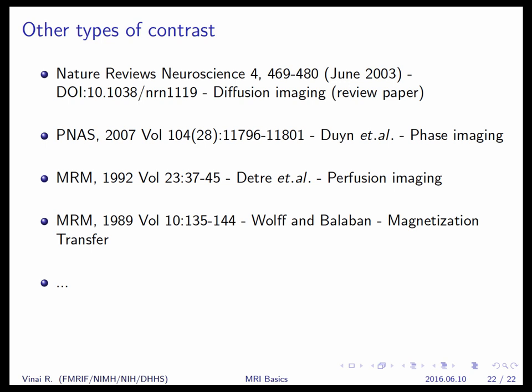We can maybe deconvolve that and go back, but the problem is that latency varies all over space depending on the vasculature, so it's hard to go back. You just have to infer within a couple seconds that's where the neural activity took place. You can give a very brief stimulus. Even a 5 millisecond stimulus, you can see a response 5 seconds later and then it dies down. That's all due to the blood flow response, the hemodynamic oxygenation response. I don't know if that was your question.